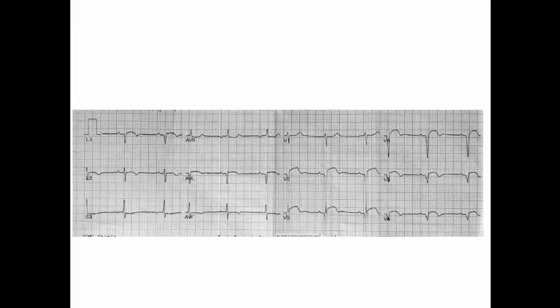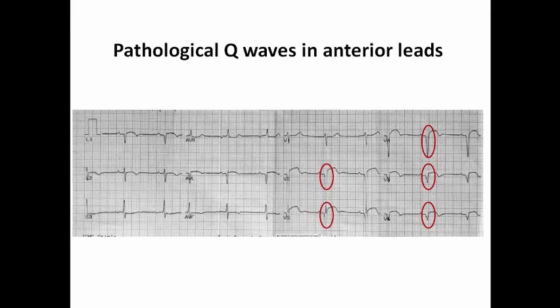In this ECG example, we can see pathological Q-waves in V2 to V3 plus residual ST elevation. This appearance is suggestive of pathological Q-waves in anterior leads, most probably caused by anterior STEMI. According to the clinical presentation, we can decide whether it is acute STEMI with ongoing infarction or an old infarction.